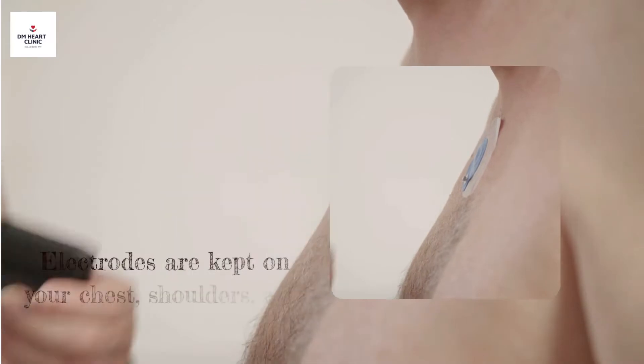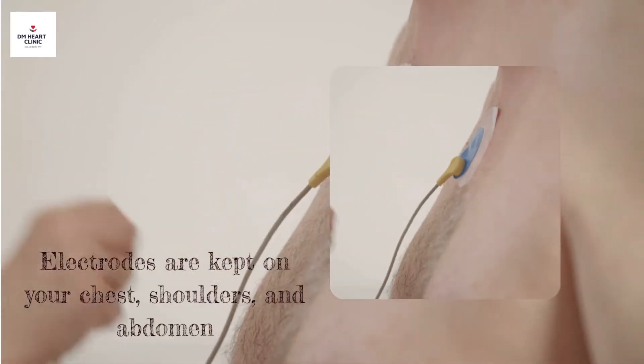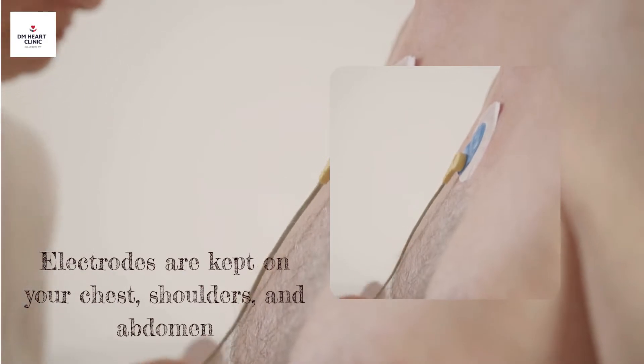Before the treadmill test begins, a technician will put sticky patches on your chest, shoulders, and abdomen. These are called electrodes.